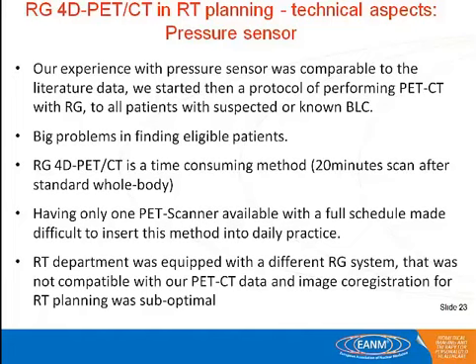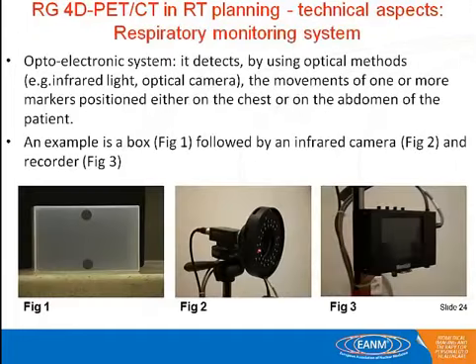And the department, at the moment, decided to switch from another type of respiratory gated method, so there was no longer any compatibility. We had to use it only for diagnosis. So, well, it was a try, but actually we didn't proceed with that. But we didn't give up on respiratory gating. We said, we want to do it again. So we changed it.